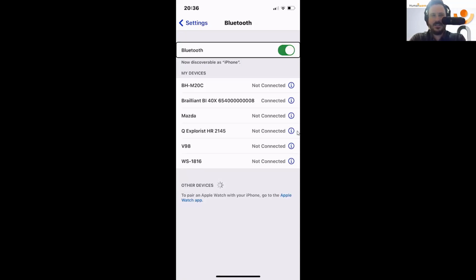So now I am prompted with USB connections. The Braille display put me into the connected devices. Now in the connected devices, as I space through, I do have my iPhone option followed by one cell full of 8 dots, telling me that it's connected. Okay, it's paired up. As I continue to space through to see what other connections I have: reconnect devices, back, and then USB connections. So I have those available to me at the moment. I'm going to press enter on iPhone.